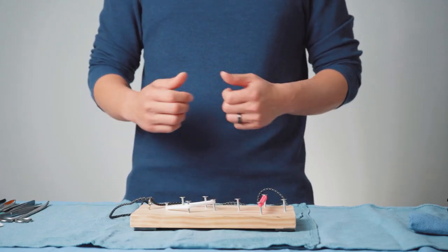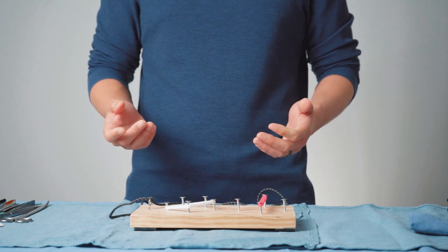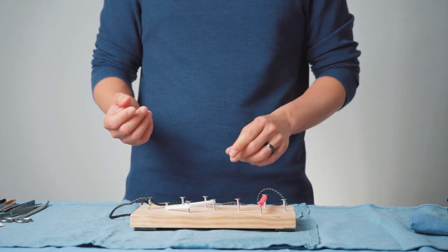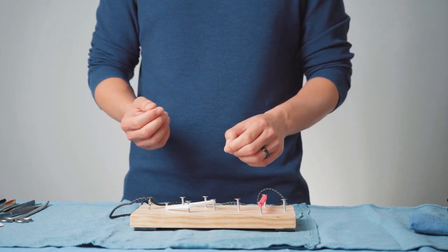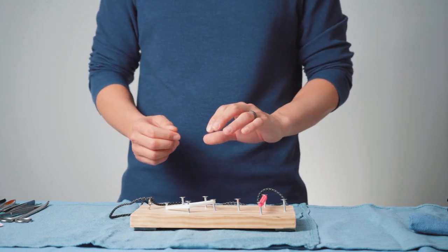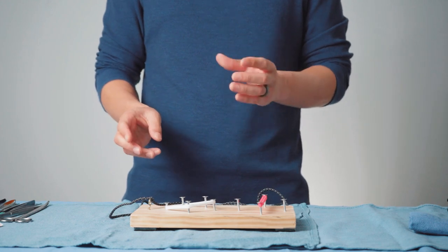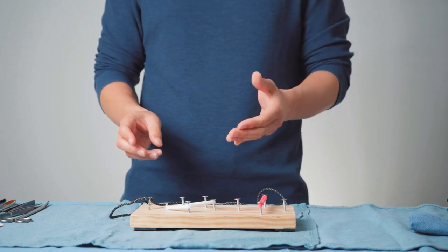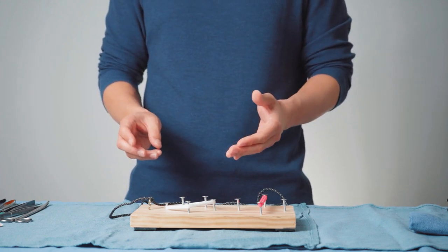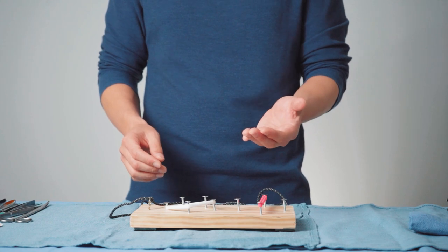Now we're going to go into the specific steps that go into tying a knot. This example is a one-handed knot, meaning that whichever hand you choose, that hand is carrying out all the major acts in tying that knot. I'm going to be using my left hand.